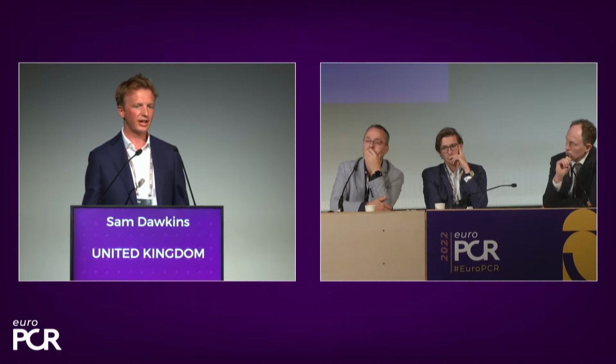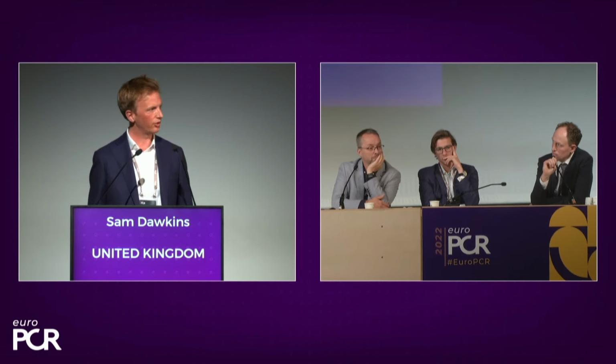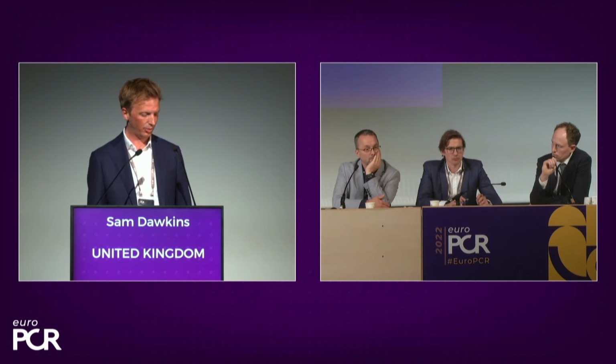And is Pascal P10 your first choice in restrictive leaflets, or what would you have done if the pathology was more commensurate with a restrictive leaflet? Yeah, the challenge with P10 is that it's bulkier. So if you're steering around cords, it can be a little bit more difficult. But you can always elongate it and sort out the orientation in the atrium and then recross. So I think that's a problem that is surmountable. But usually with commissural pathology, you'd use ACE.